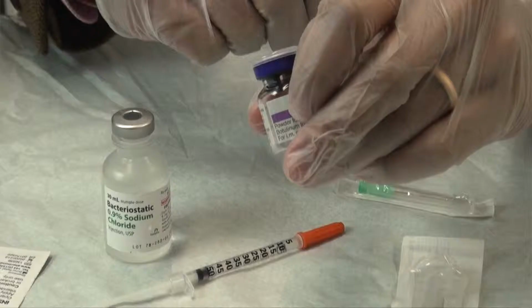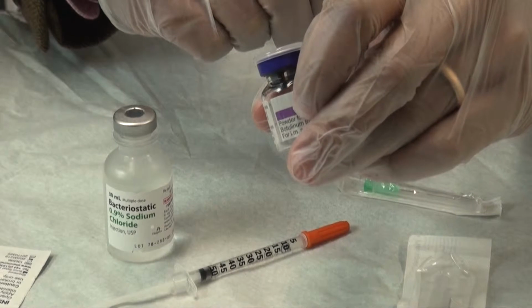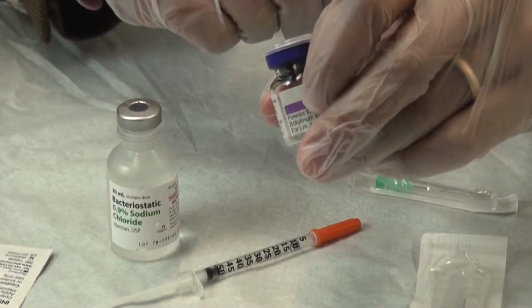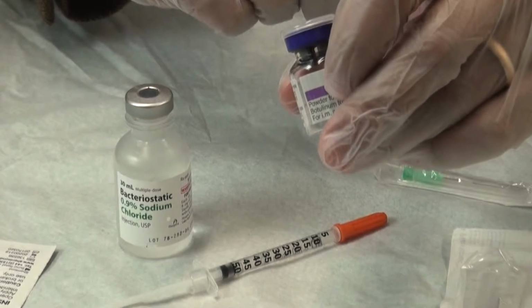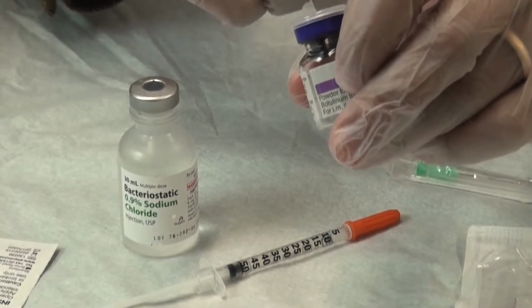I'm going to reconstitute with bacteriostatic saline, so 0.9% sodium chloride bacteriostatic. This comes in 30 ml vials and is the best way to reconstitute any botulinum toxin type A product.